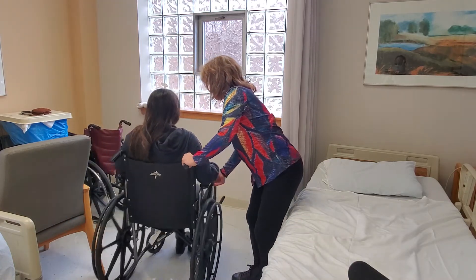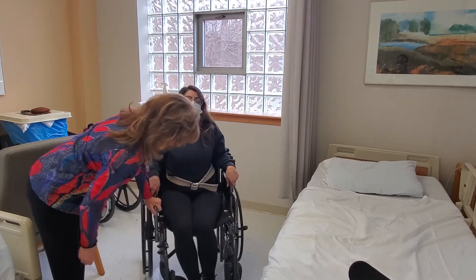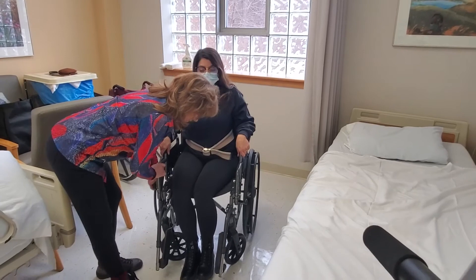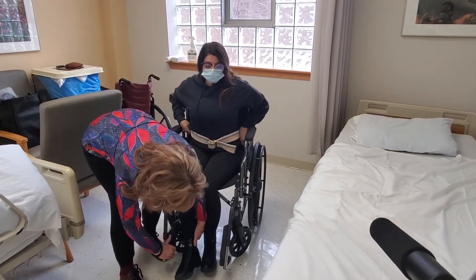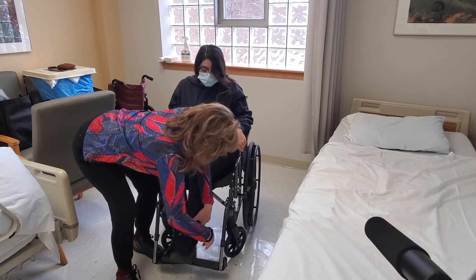The pedals are already on the chair. I'm going to turn her around so you can see. We lock the chair, put this pedal down, put her foot on it, this pedal goes down, and we're ready.